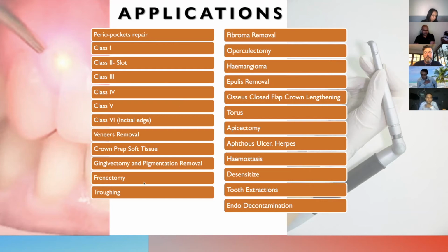Sorry, just one last question. On that note, I'm always worried about using lasers. Imagine I'm working on the tooth, and if I move around, I'm worried that I may cut the lips, or the gums, or the tongue. Are laser treatments selective or non-selective?